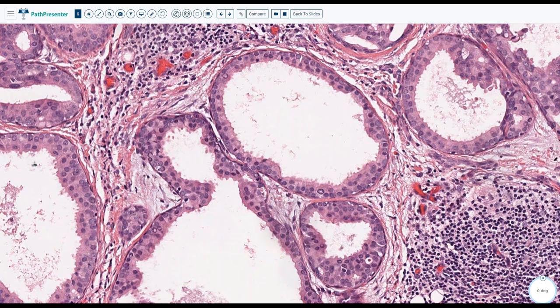Because your top differential diagnosis is metastatic squamous cell carcinoma, right? So when you have something crazy, and you find it on a small core biopsy or fine needle aspiration, and you see crazy, ugly, poorly differentiated cells, sometimes it is not easy to call it from the get-go, oh, this is salivary duct carcinoma. You would like to go with the common thing, as I said, the metastatic squamous cell carcinoma.